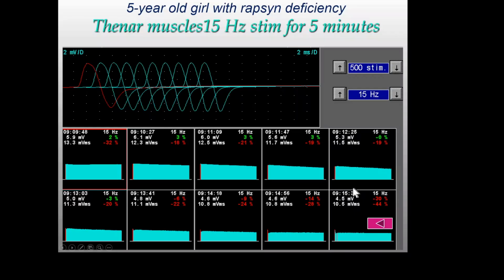In congenital myasthenia, we may have other findings. If we have a presynaptic condition, maybe we don't see any decrement at all with just 10 stimuli, but by exhausting the stores of acetylcholine with hundreds of stimuli, we can see how the amplitude continuously decreases, and we get this effect not seen in a normal motor end plate or in ordinary myasthenia gravis.